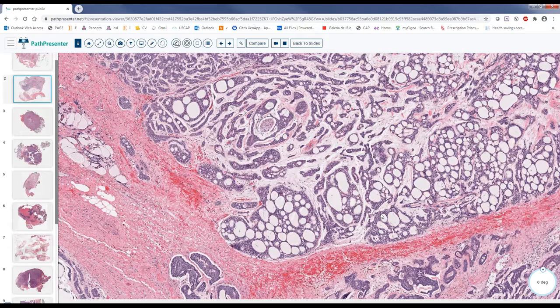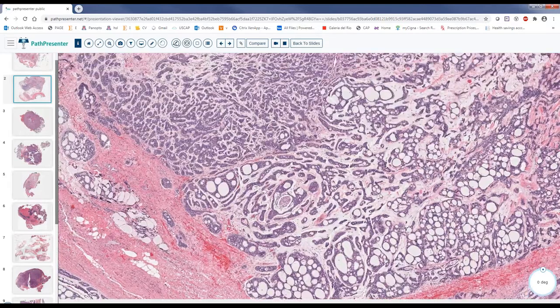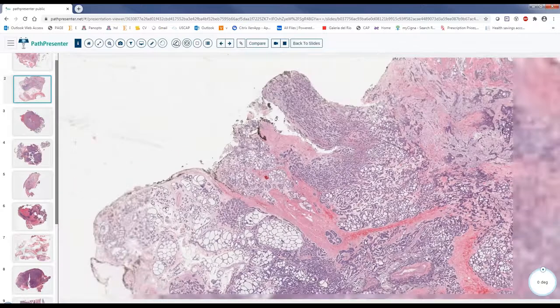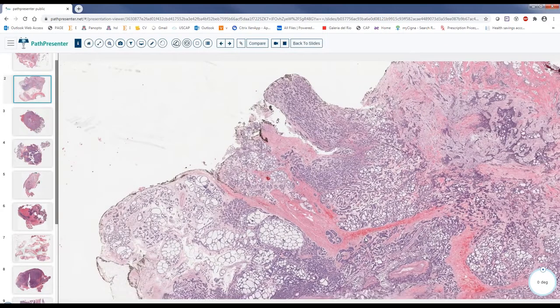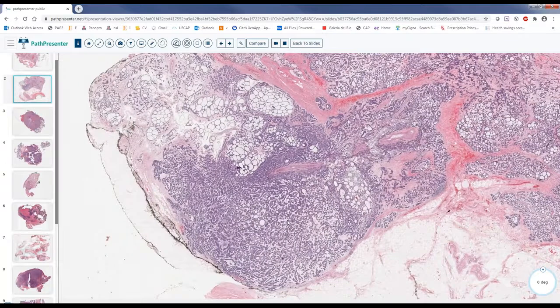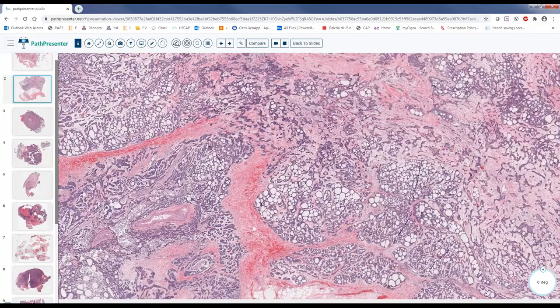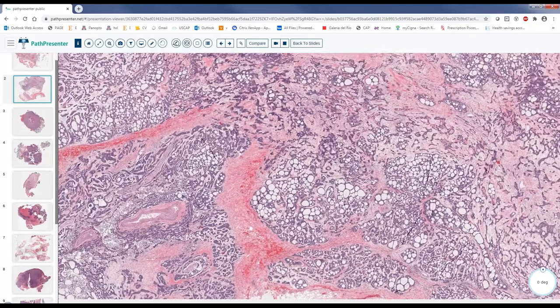So there we saw adenoid cystic, and these cystic spaces within the tumor. Technically, we don't see a real big cyst as we see, for example, in mucoepidermoid carcinoma, and this is important. If you have a major cystic component, it's kind of against adenoid cystic carcinoma. The cystic part is not making a big cyst; it's just making these small cysts here and there.